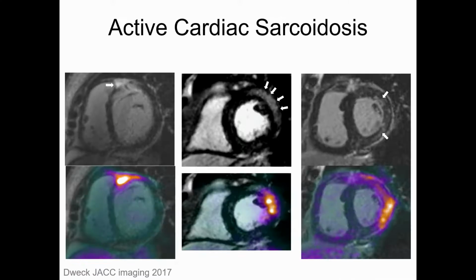So just to finish off, cardiac sarcoid, we've talked a lot about cardiac sarcoid this morning. We do quite a lot of MR from the respiratory physicians just to rule out cardiac involvement of patients with sarcoidosis. And sometimes we do see it in quite a patchy distribution. It can take different forms, different areas of the heart, patchy granulomatous disease. I guess what is really important is to know whether it's active inflammation or whether it's old, burnt-out sarcoid. MR struggles to tell you that.